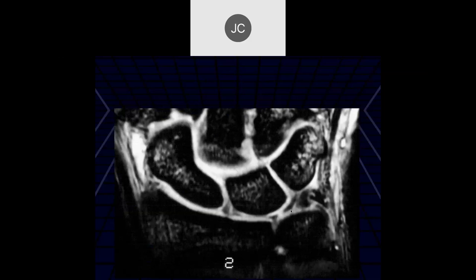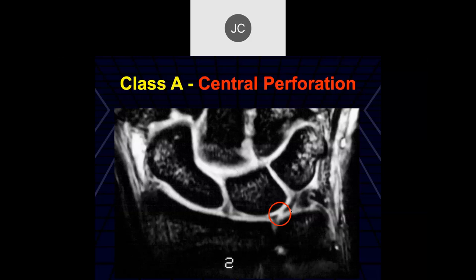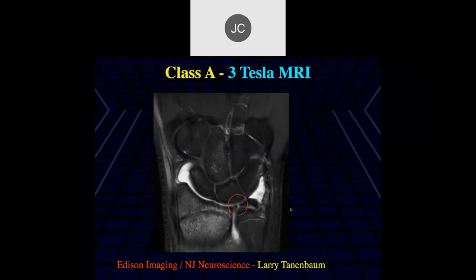Here I see increased signal in that central disc — the TFCC. So this was another Class A central perforation. And here's one on one of the early 3T images showing a little central perforation.